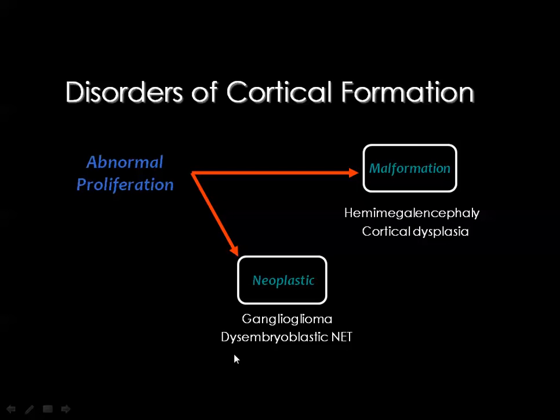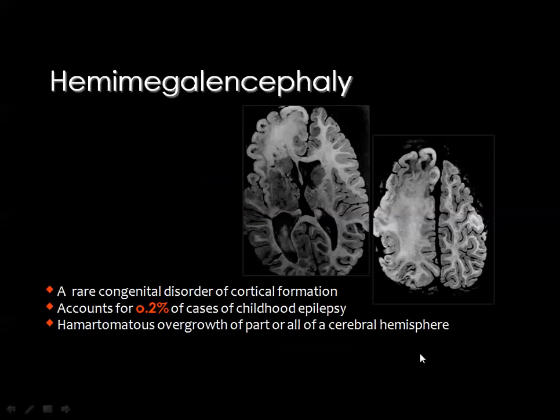Then starting first with hemimegalencephaly, which is a rare congenital disorder of unknown etiology, and it accounts for 0.2% of the causes of childhood epilepsy or seizures.